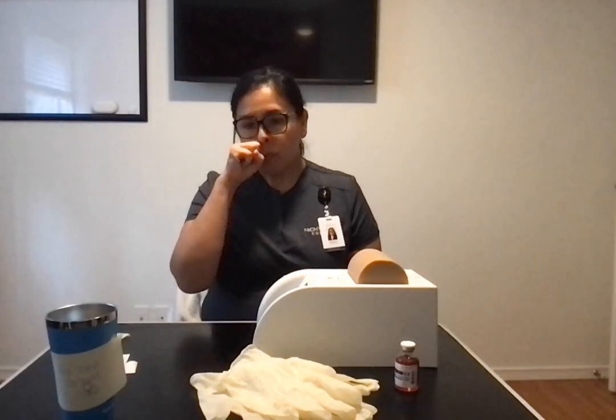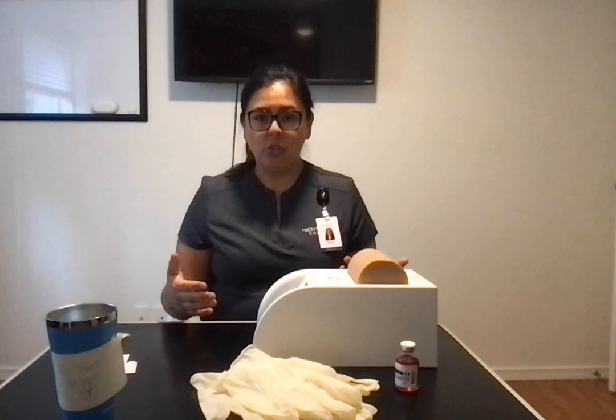So after I verified the medication, I'm going to go through the 6 rights to make sure I have the right patient, the right drug, the right dose, the right route, the right time, and the right documentation. So after I've verified all that, I'll bring my supplies into the patient room. I'm going to close the door behind me, ensuring patient privacy.